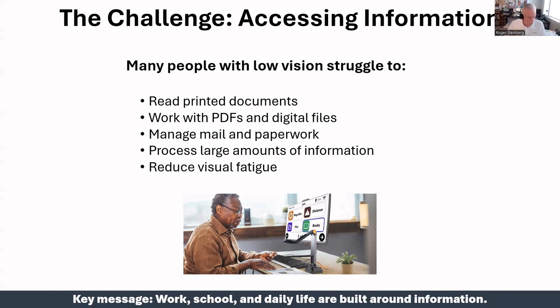I know we have a couple of vocational rehabilitation counselors on the call here. We want people to be able to get as much done as possible in as short a time as possible. And certainly fatigue can play into the ability to produce, certainly in a work environment, but also in school environments. So Prodigy is designed to help reduce effort and make information easier to see, read, and understand for users in the environment in which they're using the software.